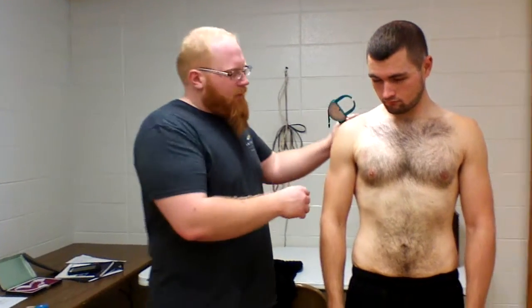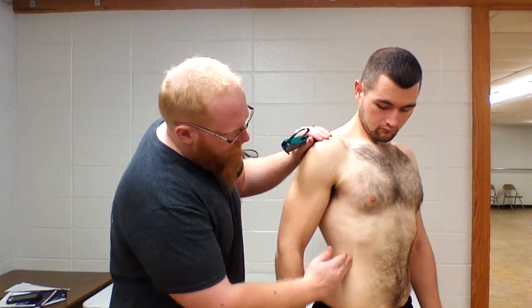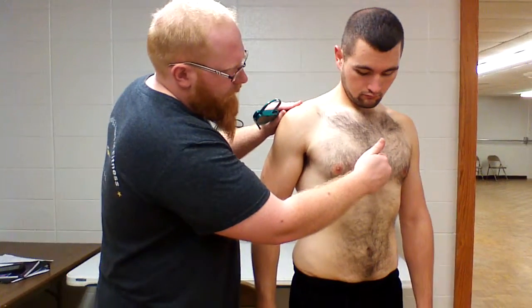The way this one works, you have what's called a mid-axillary line that runs right down here, and you want to get this right at the level of the sternum.